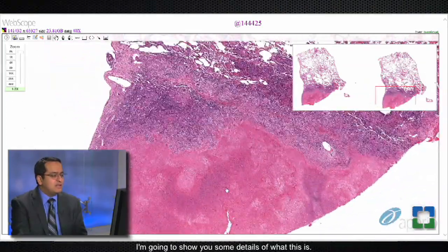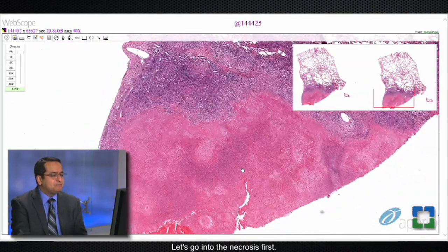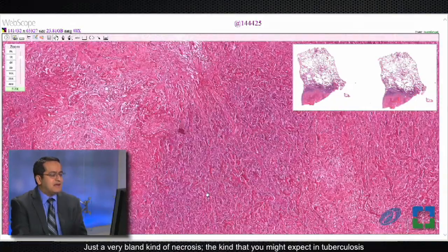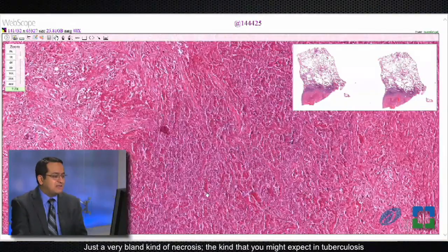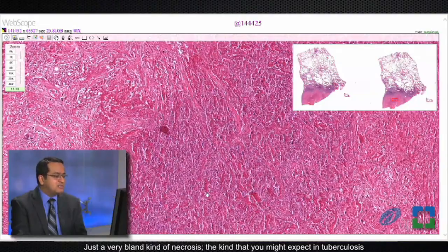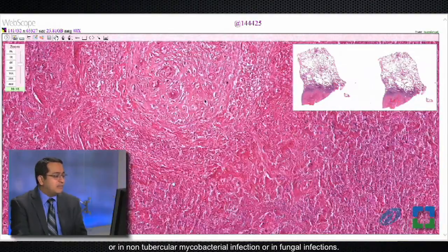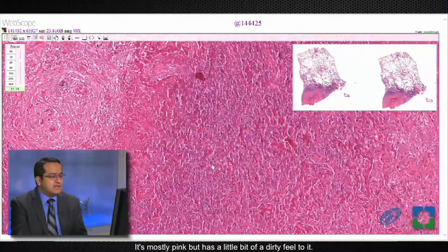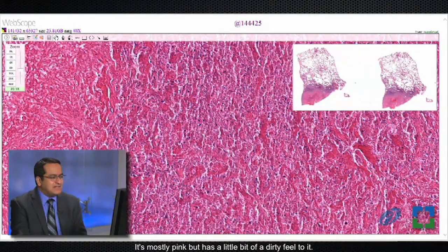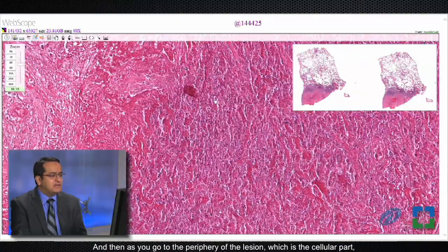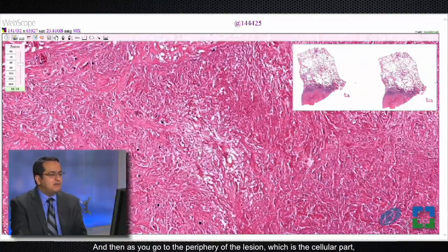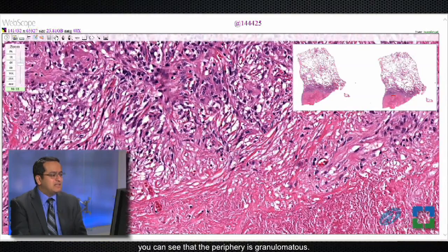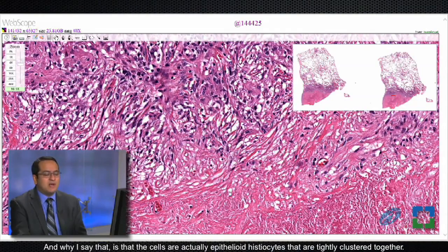Let's go into the necrosis first — just a very bland kind of necrosis, the kind that you might expect in tuberculosis, non-tubercular mycobacterial infection, or in fungal infections. It's mostly pink but has a little bit of a dirty feel to it. Then as you go to the periphery of the lesion, which is the cellular part, you can see that the periphery is granulomatous.